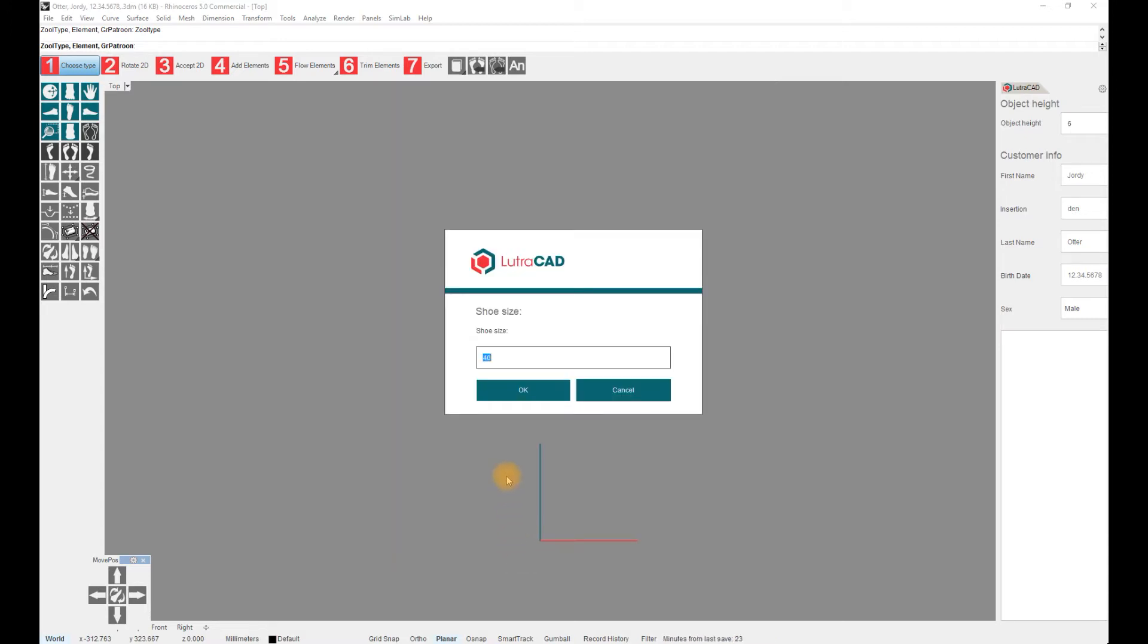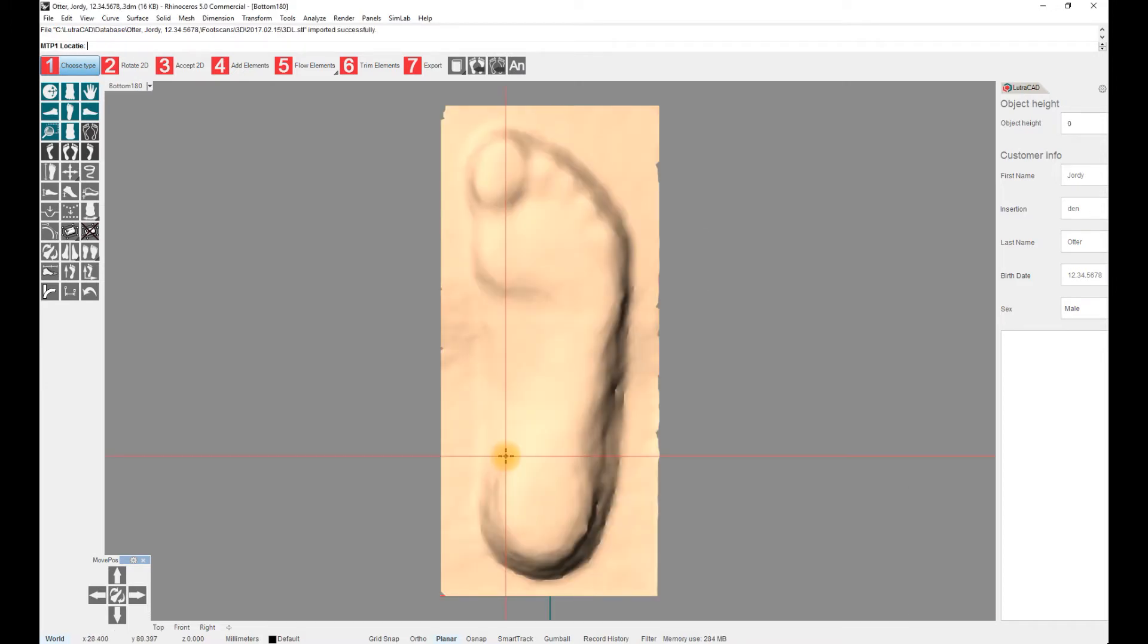You will be asked to assign a shoe size. The 3D files will now be imported.